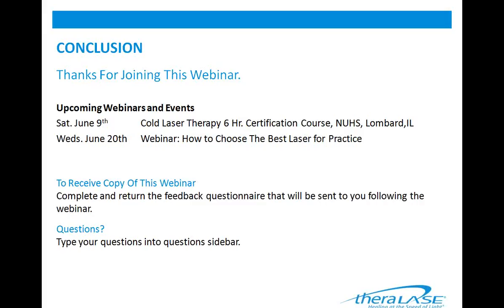And is there any age limitation for laser therapy? We do treat young patients, we treat older patients, but we adjust our dosing based on age. So for a young patient, we'll give them maybe half the dose of an adult or even less. And for a very elderly or frail patient, we might also reduce our dose. So the age might determine what dose we're going to use.